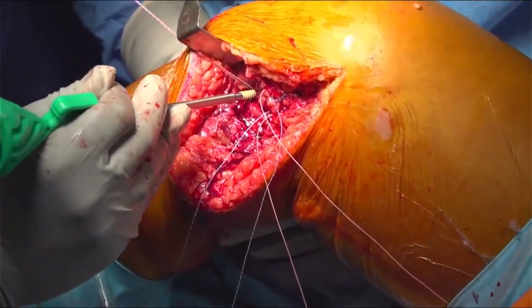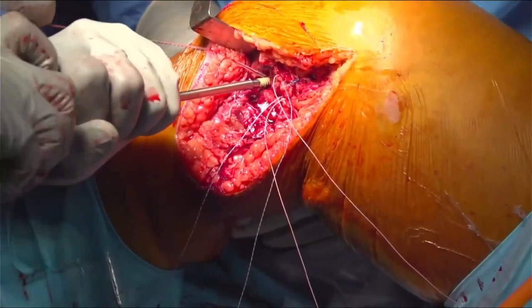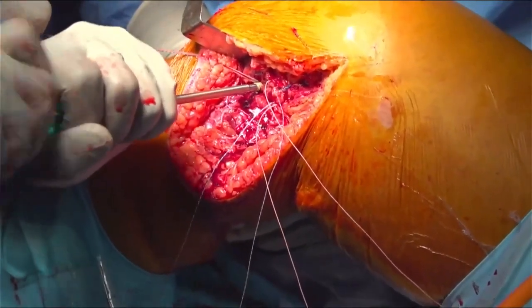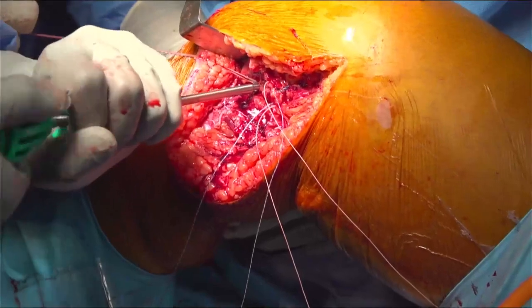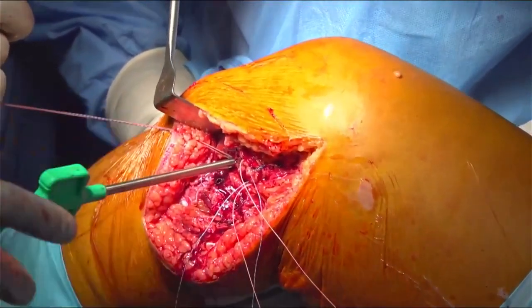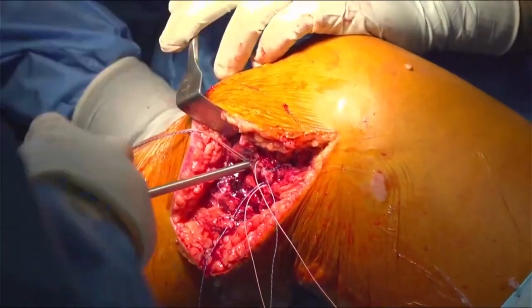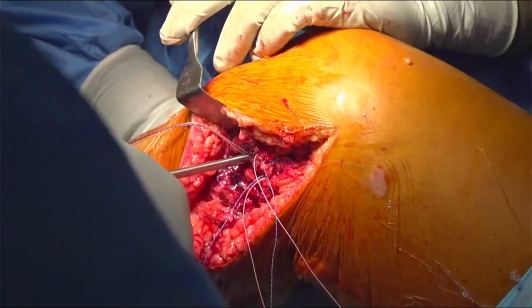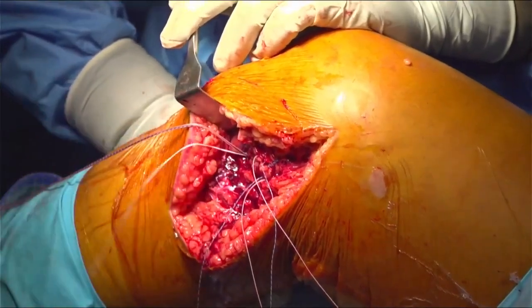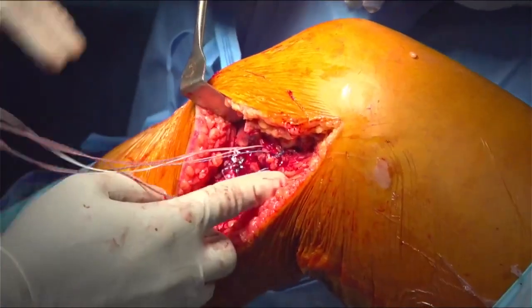Hold this, please. Hammer, please. So in this way, we are actually doing a double row repair of the meniscotibial parts of the MCL. Okay? Leave it. Leave it. So this way, we are done with the. Leave it. So with this way, we are actually done with the meniscotibial part of the repair.